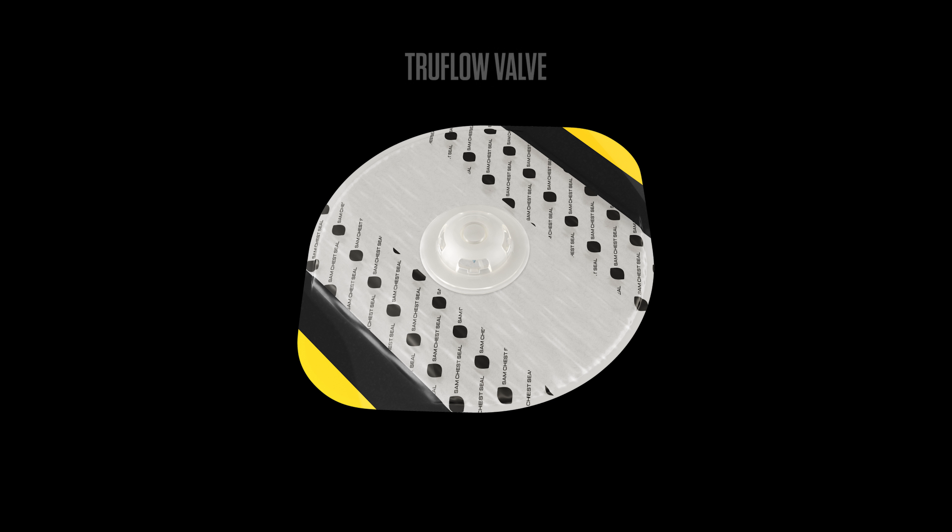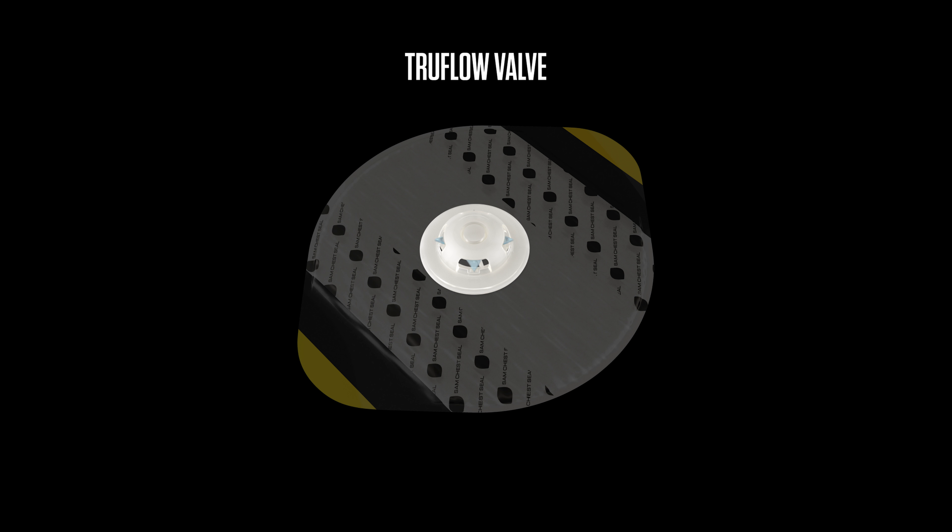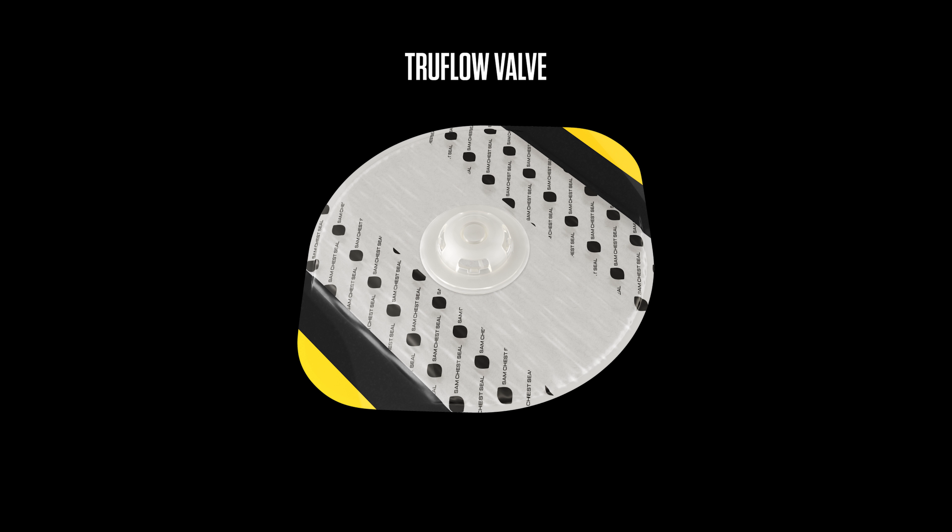TruFlow valve's rigid raised dome valve ensures one-way airflow from the chest cavity no matter the pressure applied. Large side vents minimize internal obstruction from blood, clots, or soft tissue. Whether in transport or in the presence of heavy body armor, the TruFlow valve will continue to vent.